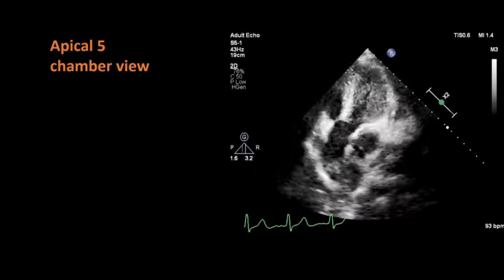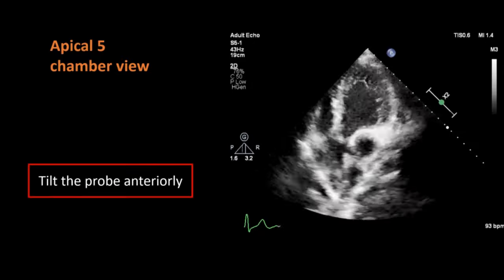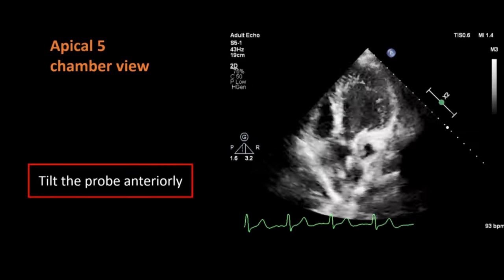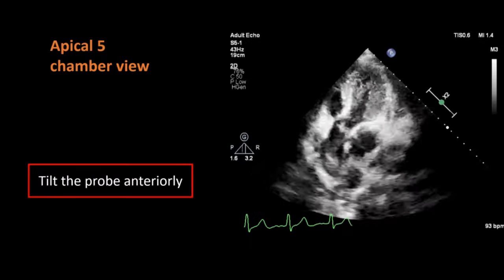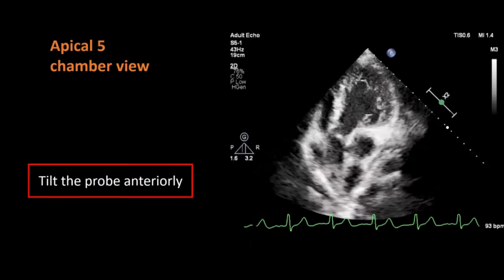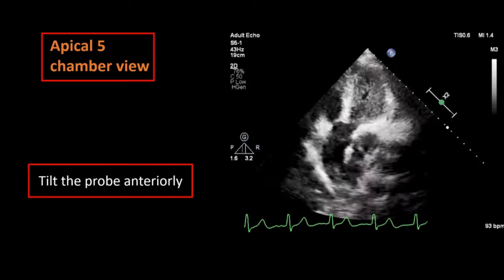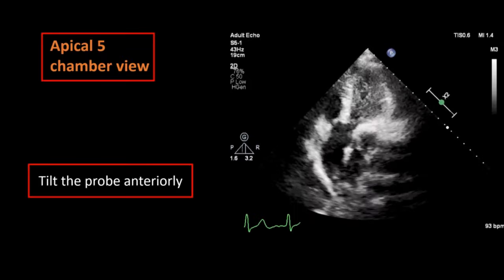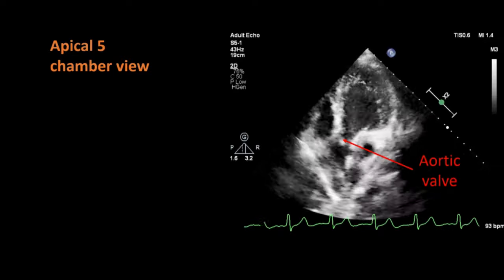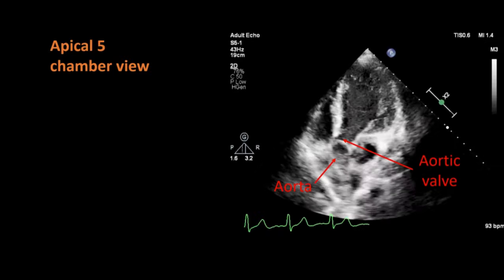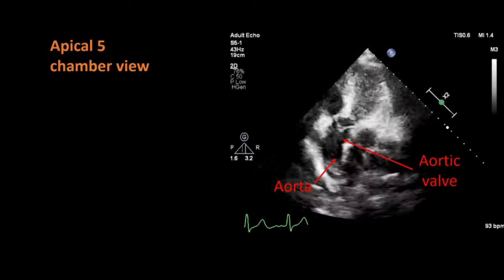By tilting the probe more anteriorly, we can obtain an apical 5-chamber view of the heart. Additionally, in this view we can see the left ventricular outflow tract opening into the aorta through the aortic valve. We can look for the presence of aortic stenosis or aortic regurgitation in this view.